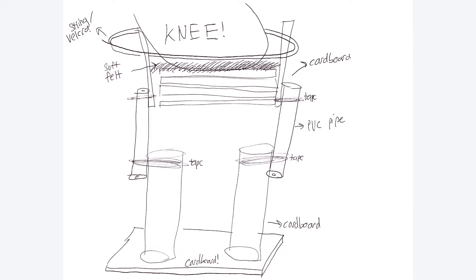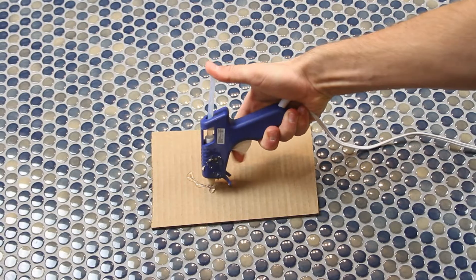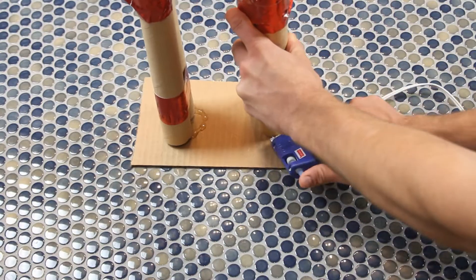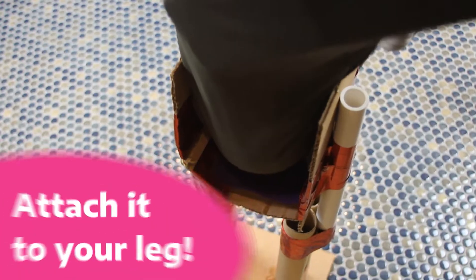Sticking to the plan, we then wanted to glue the bottom onto a cardboard sheet to sort of resemble a foot and take some pressure off of it. And finally, this prosthetic is no good if we can't really attach it to our leg.